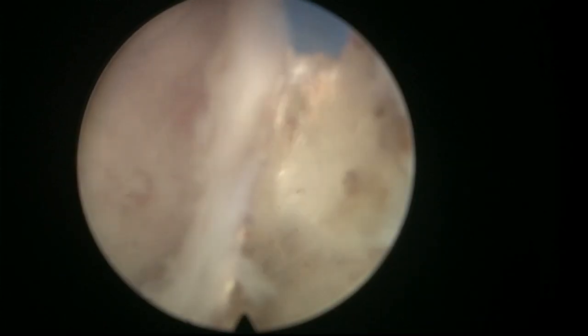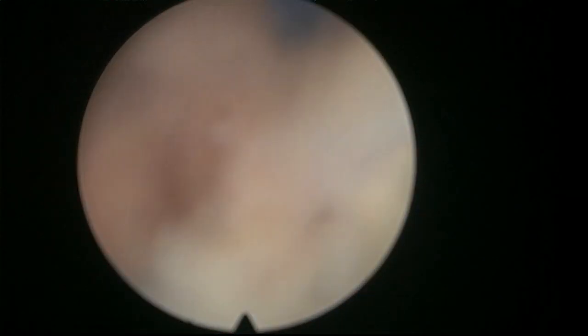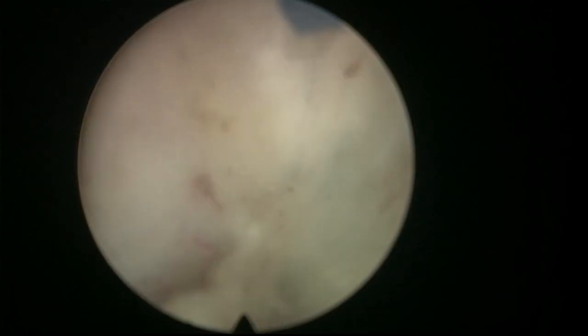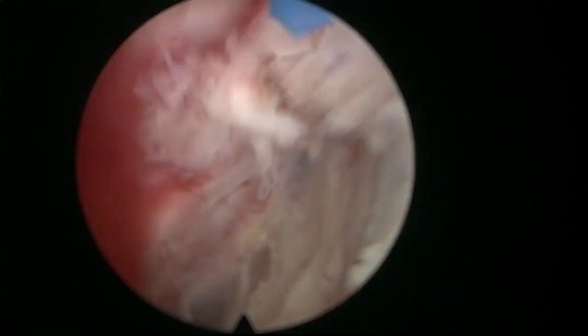It's a little bit uncomfortable. We don't have very good visibility for the moment. It'll get better. Now let's see if we can follow the nice plane. Maybe get some better hemostasis.